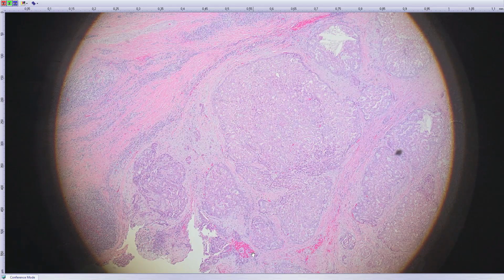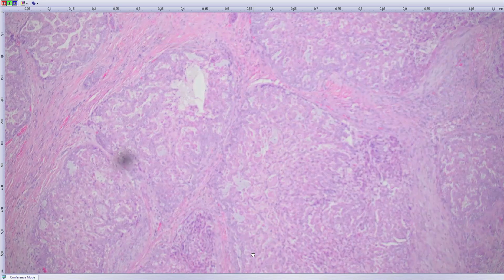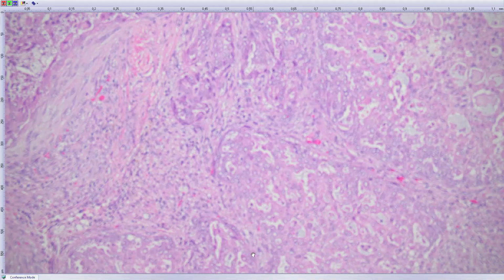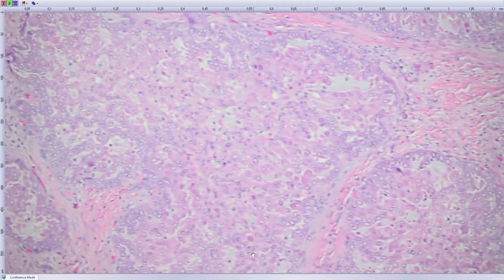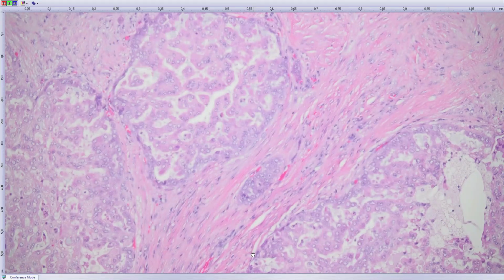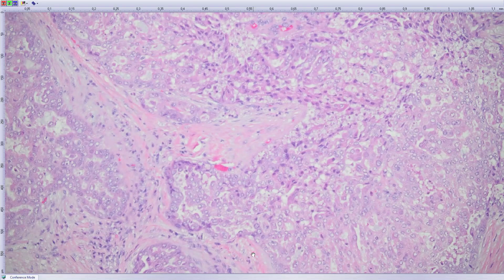A 46-year-old woman with a tumor of the thyroid. And a very important thing is that this lesion, which is quite clearly a low-grade malignant neoplasm, is thyroglobulin negative. It's the first thing that should point you to the diagnosis. What could it be? If you stain it with STAT5 or S100 protein, it's always positive.